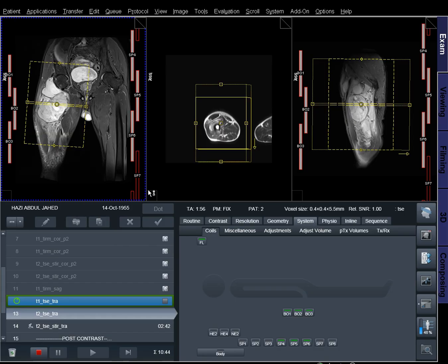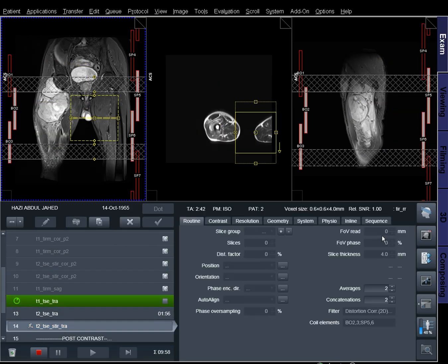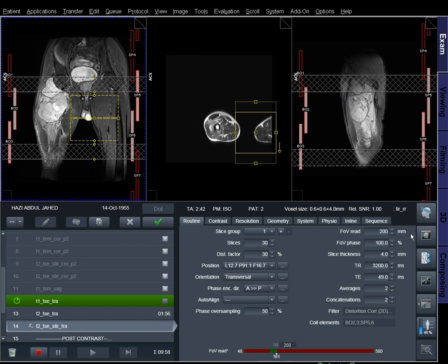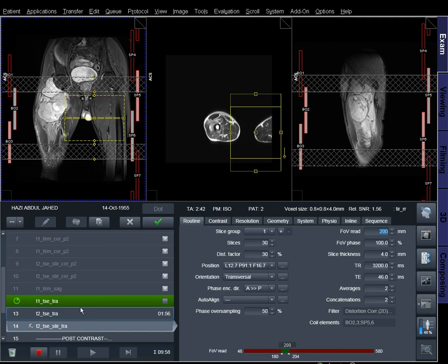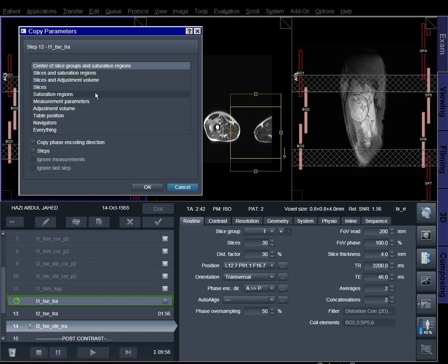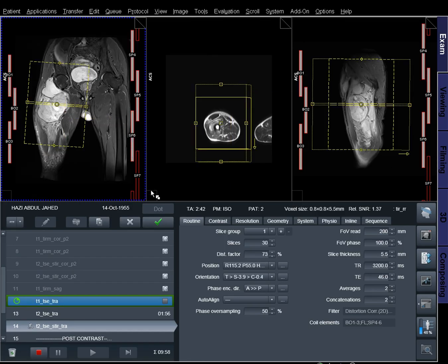Infections of bone, joint, or soft tissue. Myositis and osteomyelitis. Hamstring injury. Ligament tears. Acute trauma. Fractures. Abscess. Ulcer.